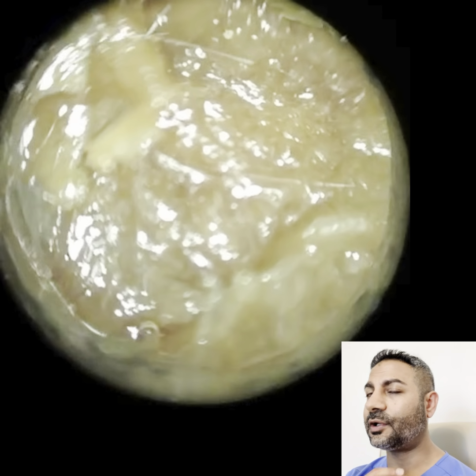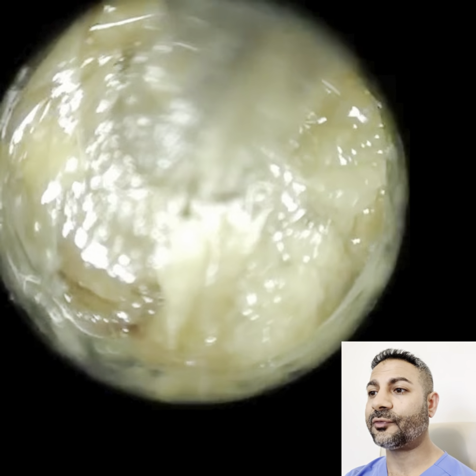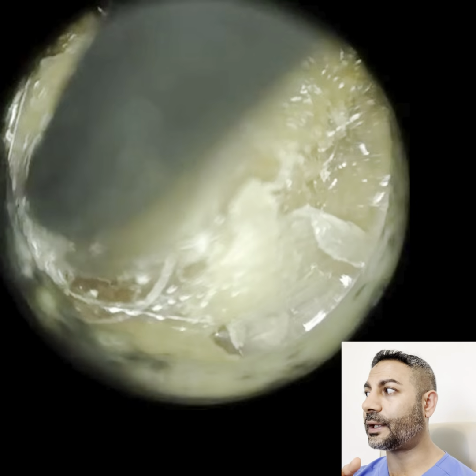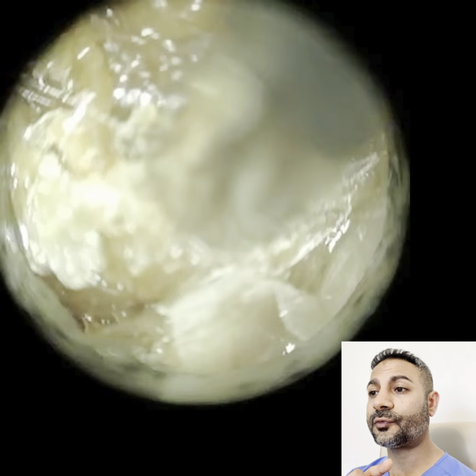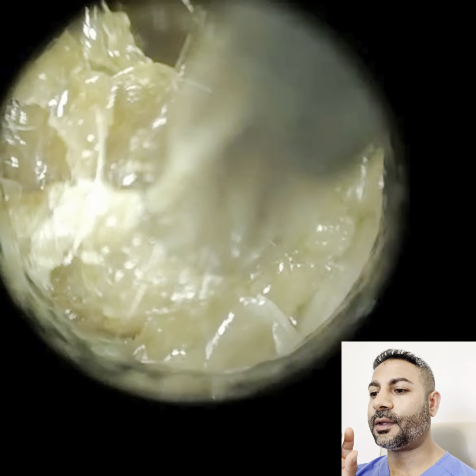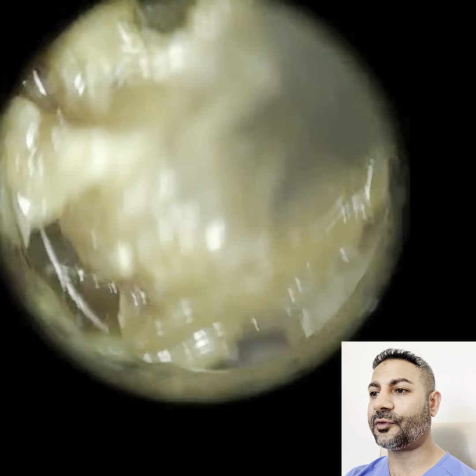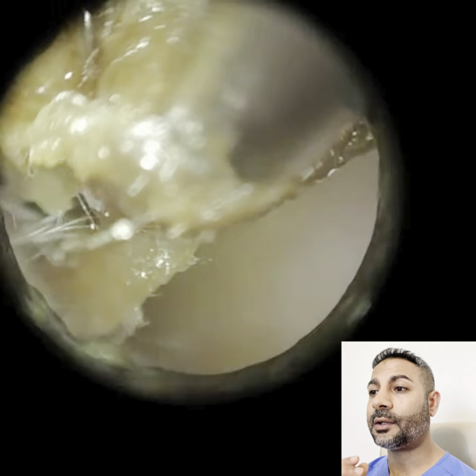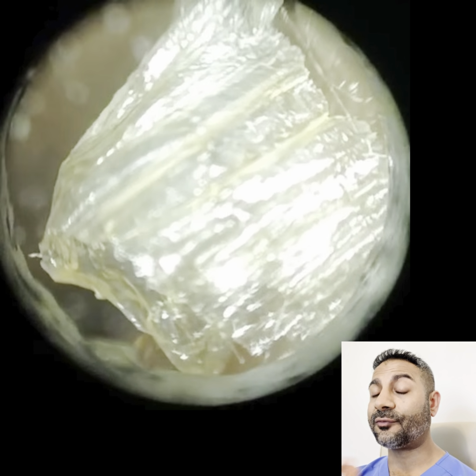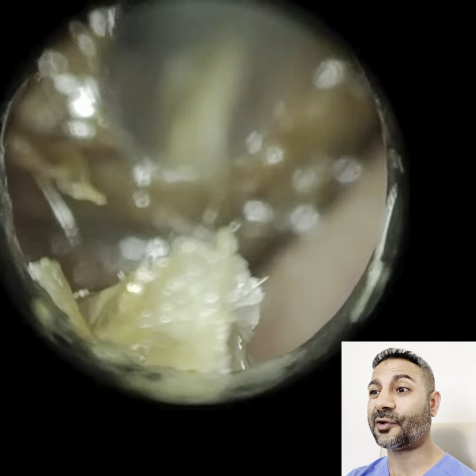Essentially, the eardrum is most mobile when the pressure is equal either side of it. So with this pressure sweep that we do, when we get the most mobility, the way we measure the mobility is we play a sound, and the sound hits the eardrum and some of it invariably will reflect back. The less sound that is rebounded and picked up by the microphone, it therefore means more sound is being absorbed and admitted into the middle ear. So that's how we measure how mobile the eardrum is.